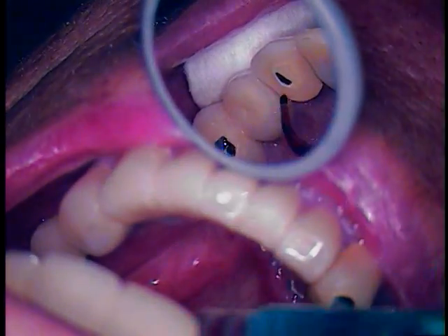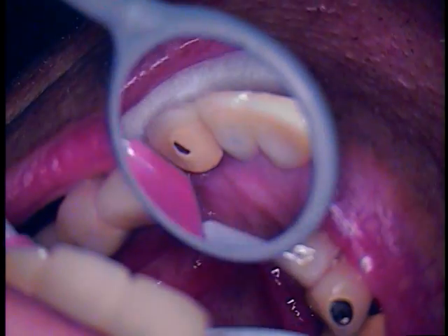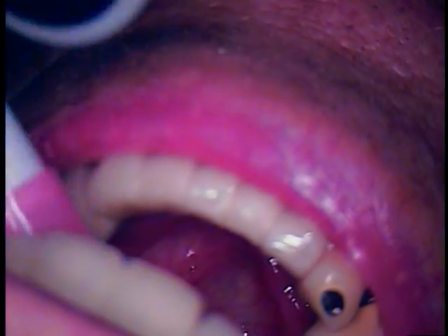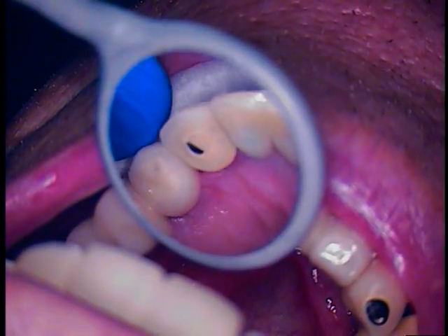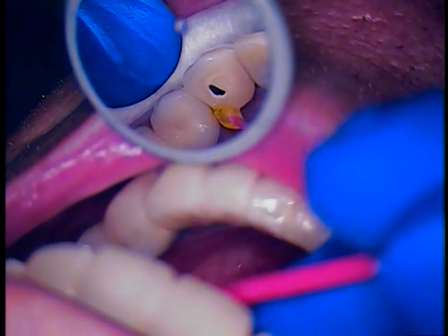So we're going to just go ahead and cavity cleanse off the surface, get rid of any debris. With a small little brush here we're going to go ahead and paint for about a minute. Looks like metal ceramic, so we'll give that a full minute of time.